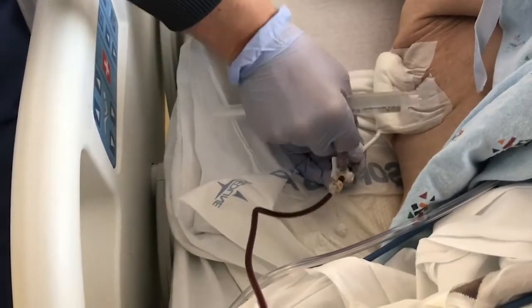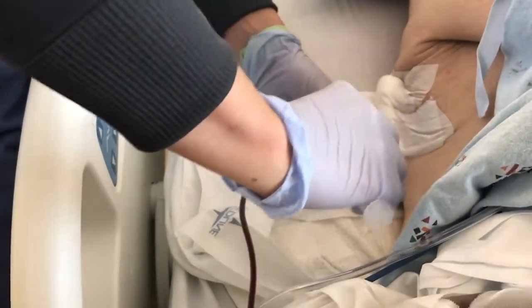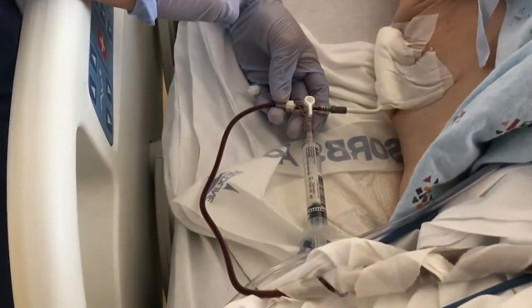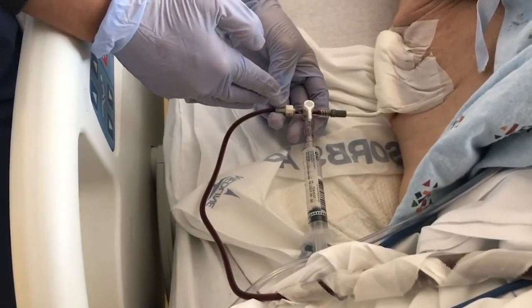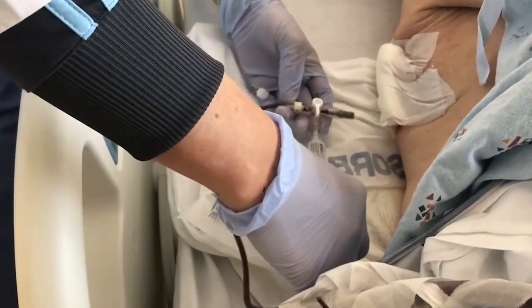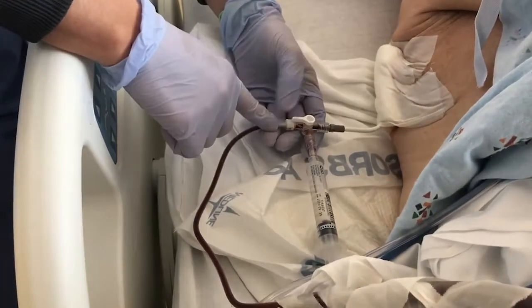When you try to flush it, you just clean the side port, which is the access port. There is a three-way stopcock which basically directs the flow of the chest tube. Right now it's open to flow from the patient into the tubing. When you want to flush the chest tube, you just turn it away from the patient — wherever it's pointing to, that channel is off.